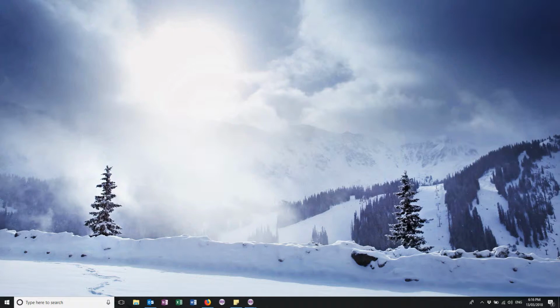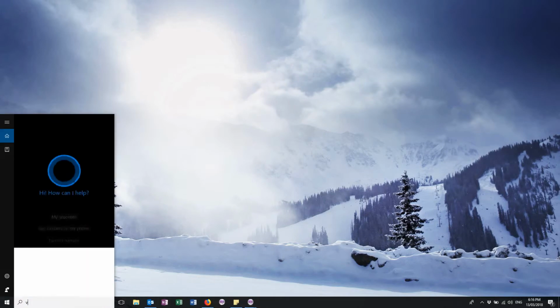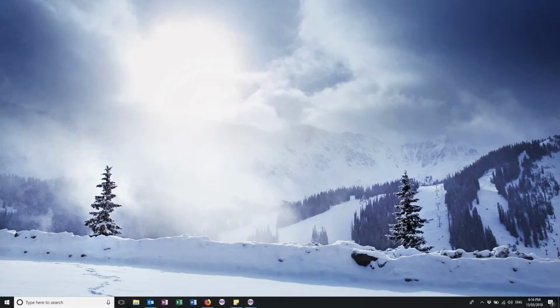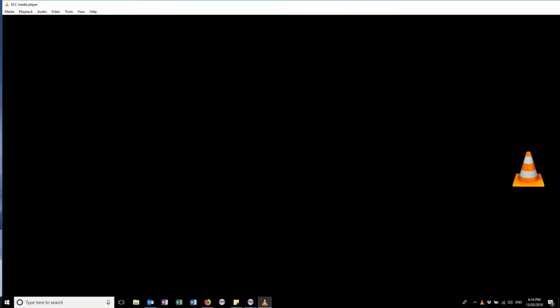And now when I'm looking for something within Windows, I just type it in this search bar here. And if you don't see this search bar, you'll probably see this circle. And when you click on the circle, it'll give you the search bar. So you click in there and you type VLC and it comes up. So you click on that. So you open up VLC Media Player and you click on Help, About.